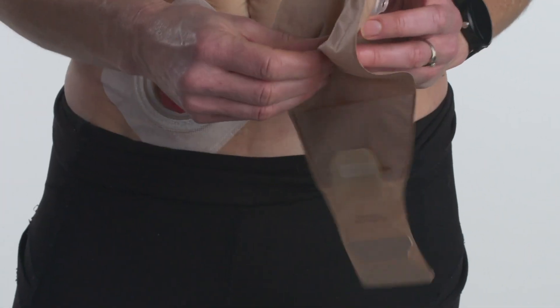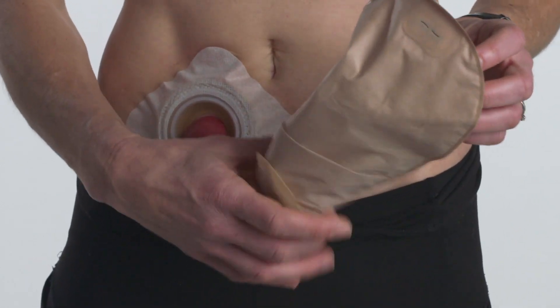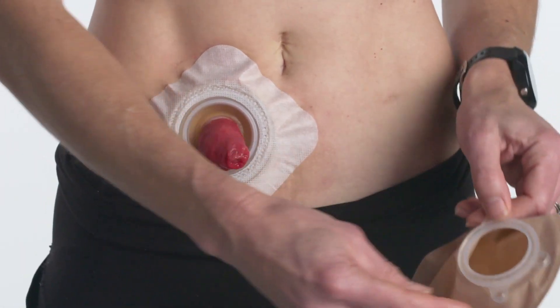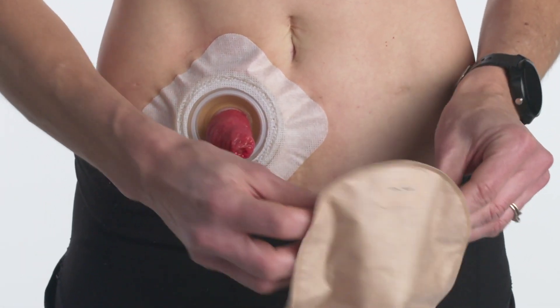Before applying the pouch, separate the sides of the pouch to allow some air to enter. Align the plastic ring, also known as the flange, on the pouch with the flange of the skin barrier.